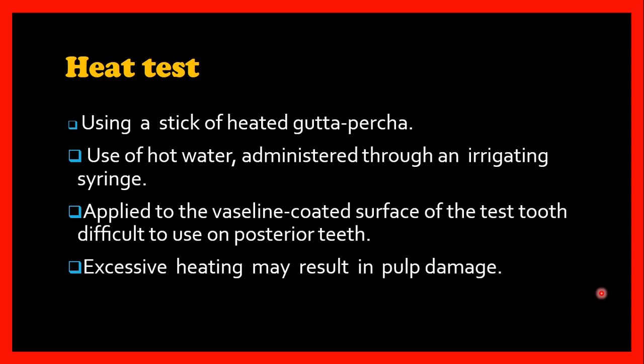Even a delayed response can occur. So before moving on to another tooth, we should at least wait for 10 seconds. That will allow sufficient time for the onset of any symptoms.